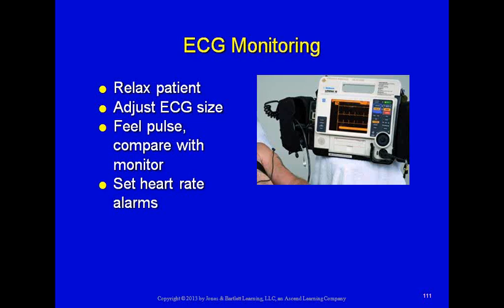Again, what you see on a monitor is electrical and does not necessarily correlate to the mechanical pumping function of the heart. So it's important that you check a pulse and compare the two. Look at what the heart monitor says the rate is and feel what the patient's rate is.